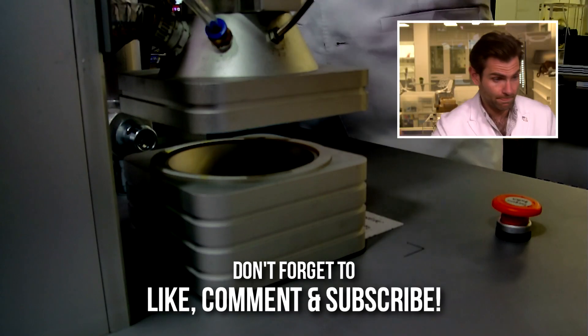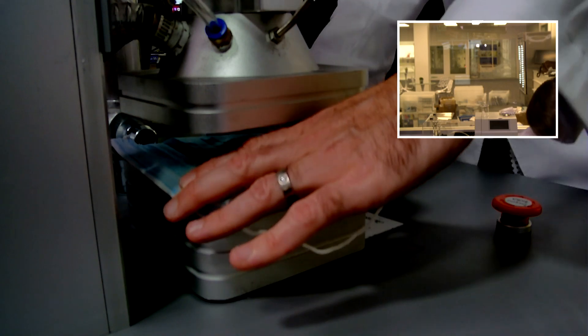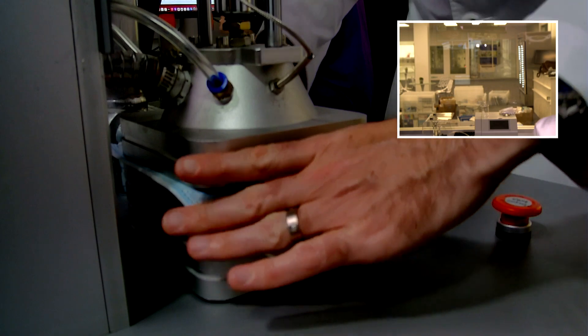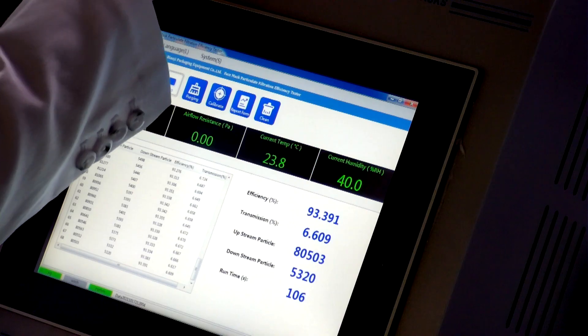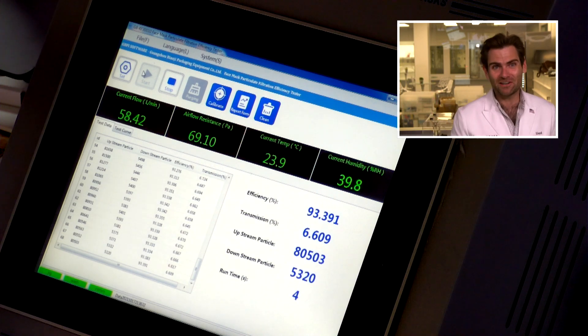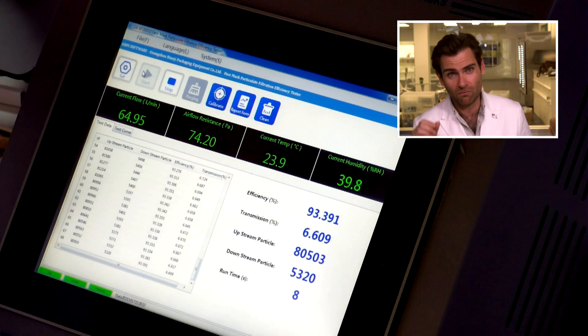The KN95 did not get a good vibe out of the Vibee — not a great track record. This is the PFE machine, the master of all. It does not accept bribes, it tells the truth. Vibee, we are coming for you with the truth machine to figure out what level of protection you offer.